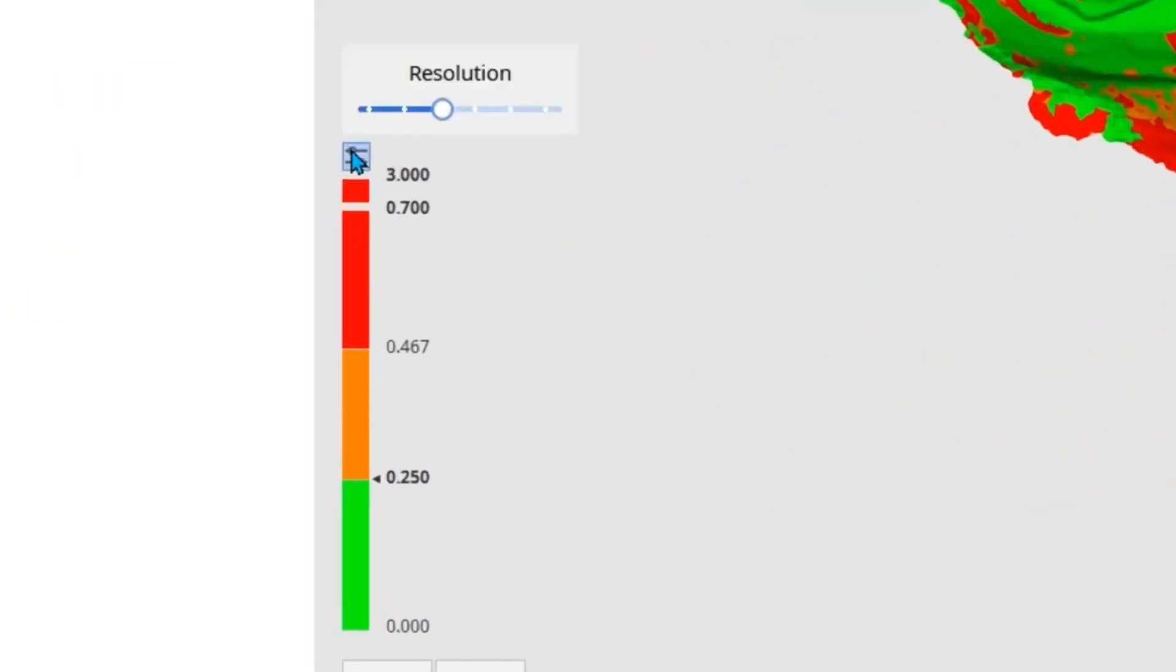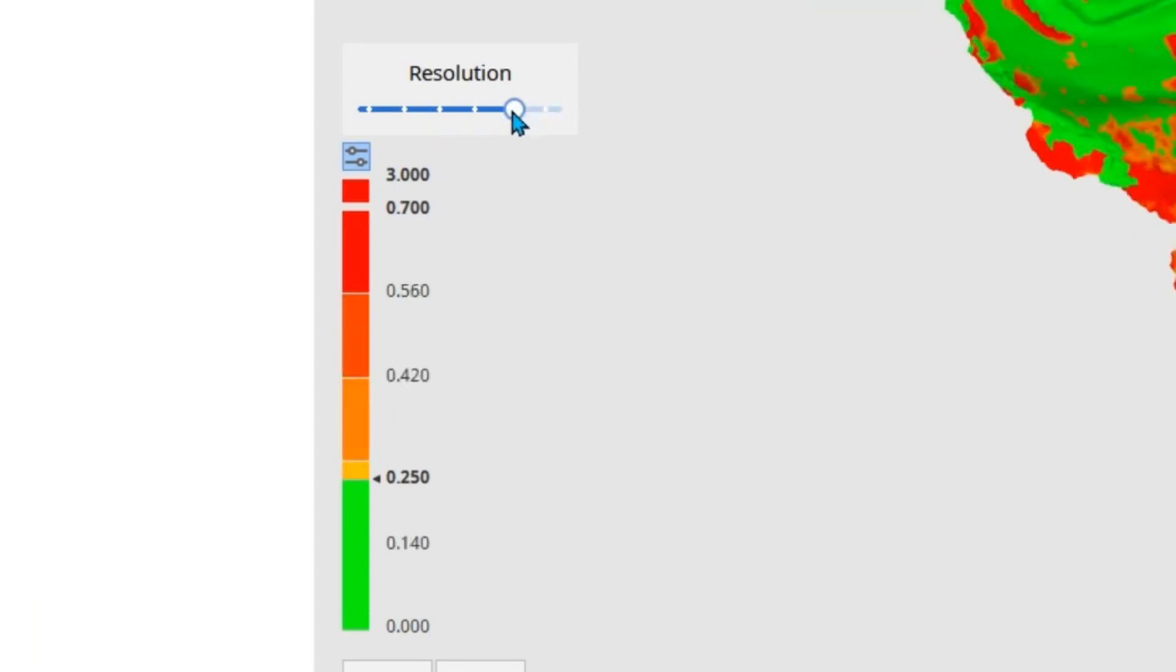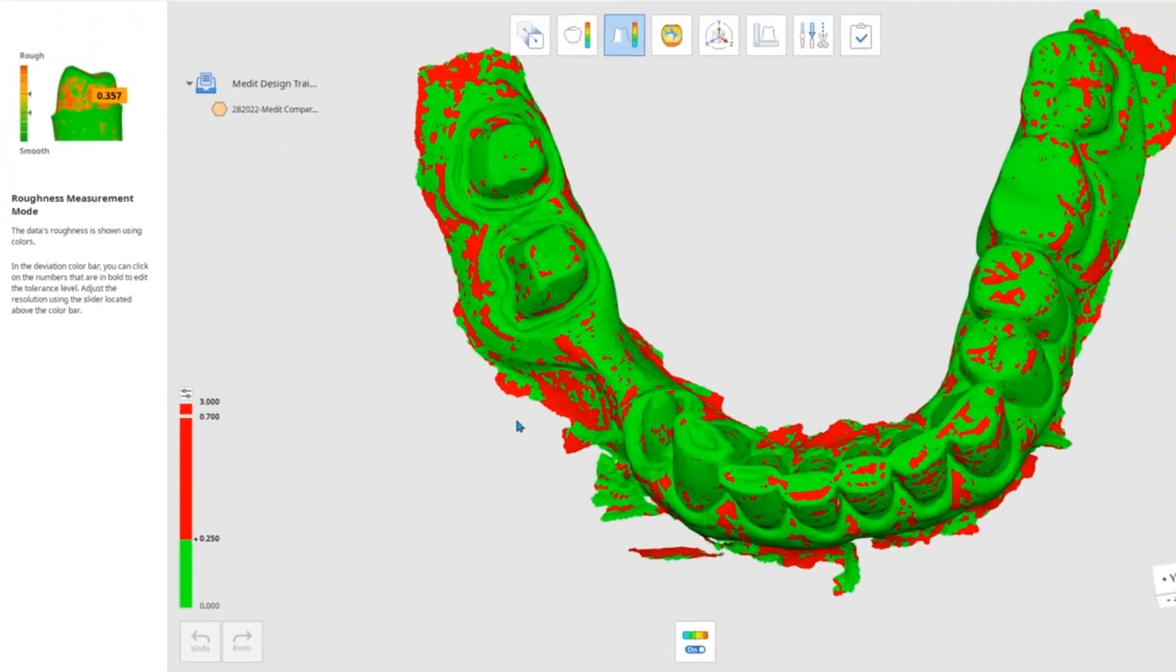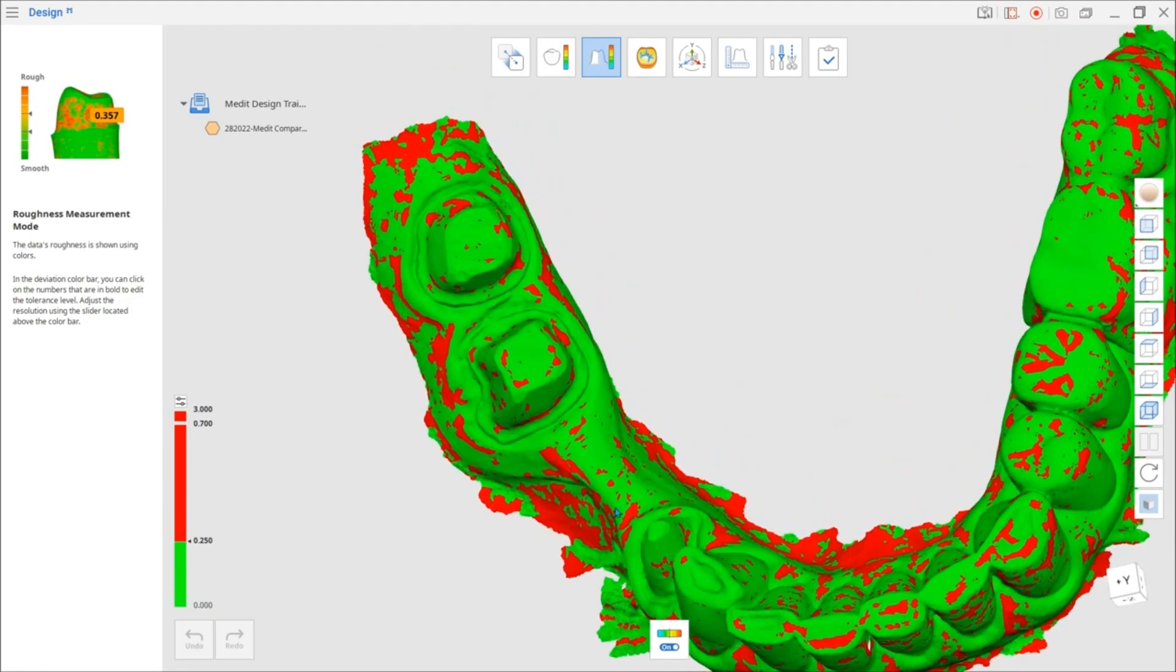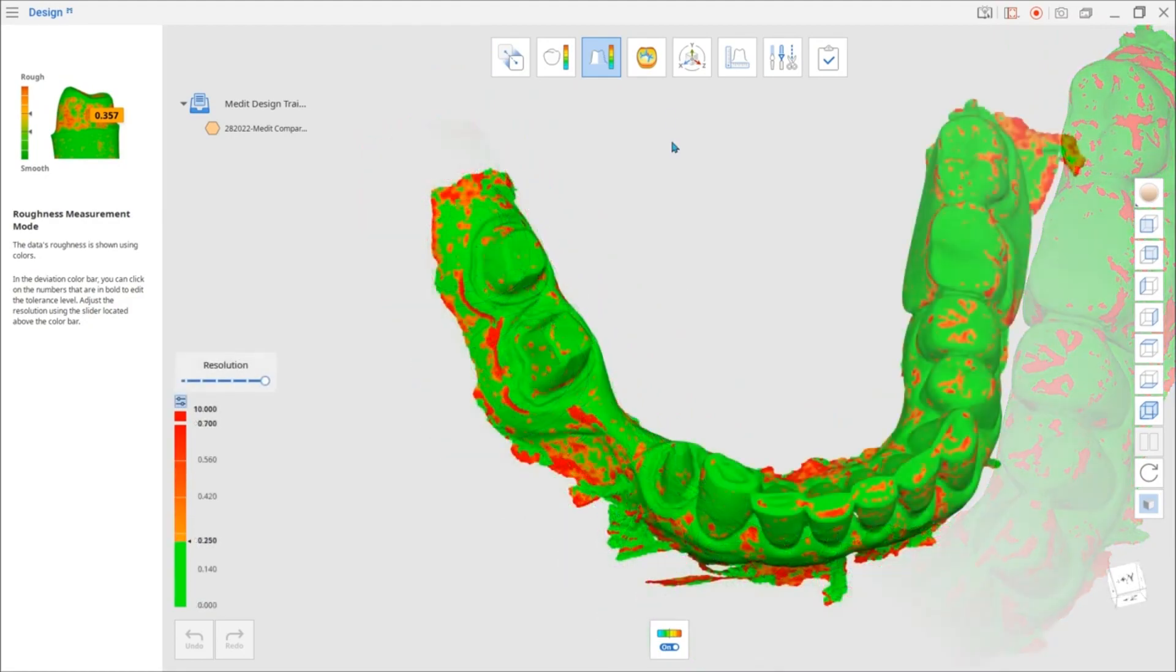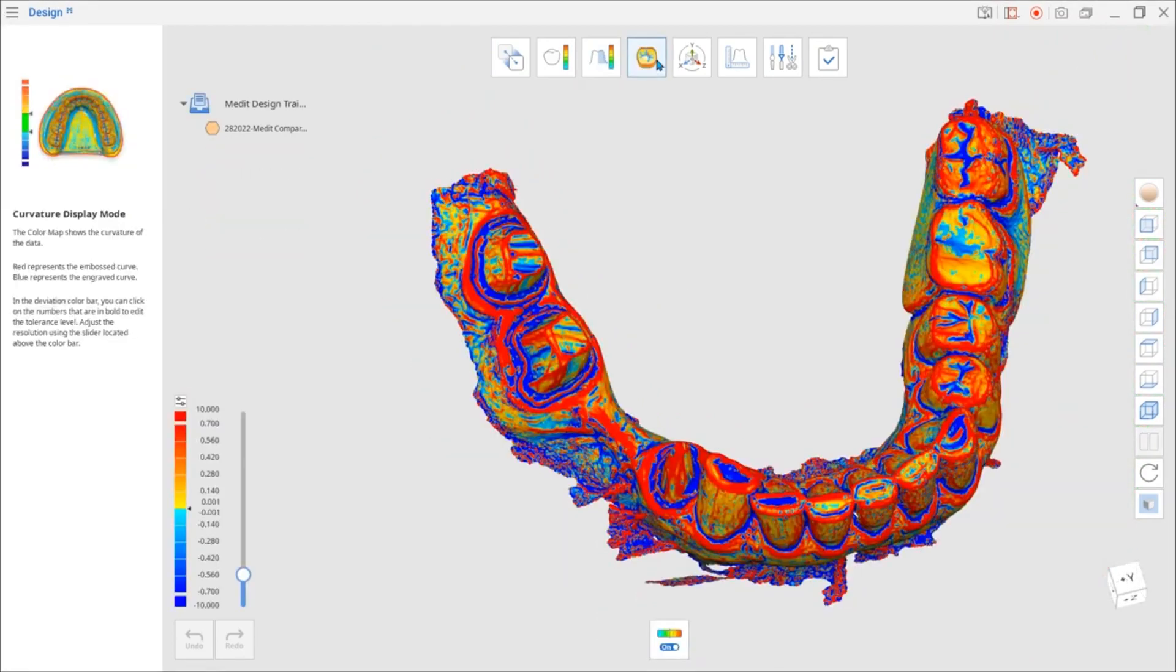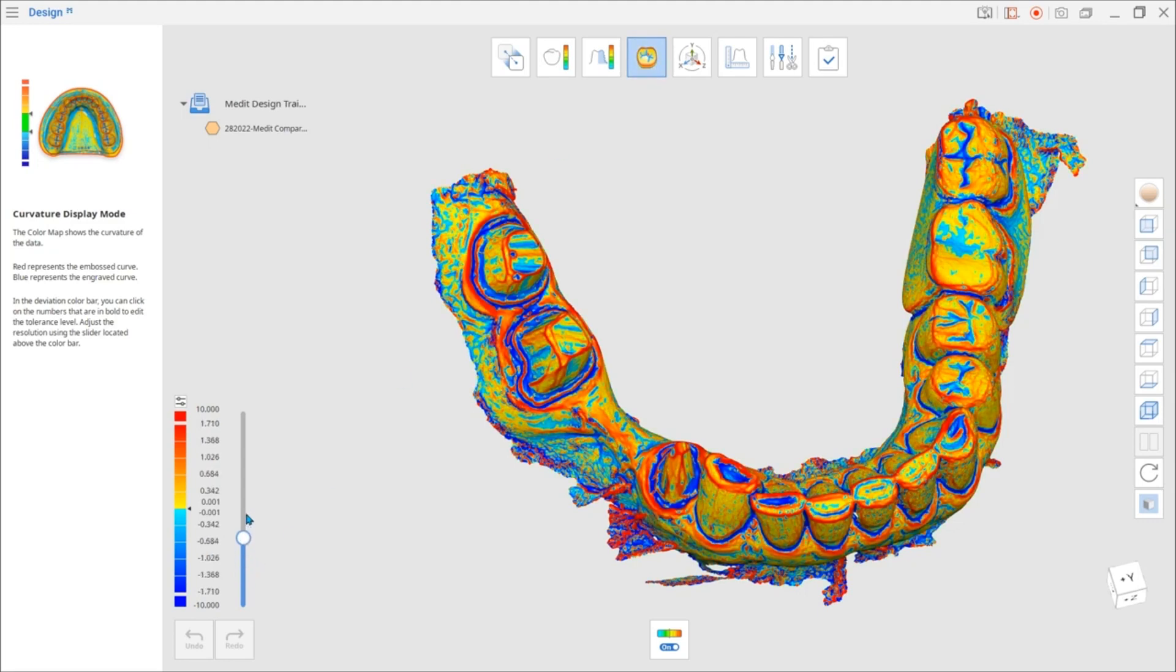Adjust the resolution of the color bar to get more detailed information. Another mode that you can find on the top is the Curvature Display Mode. This mode will help you analyze the relief of the surface.